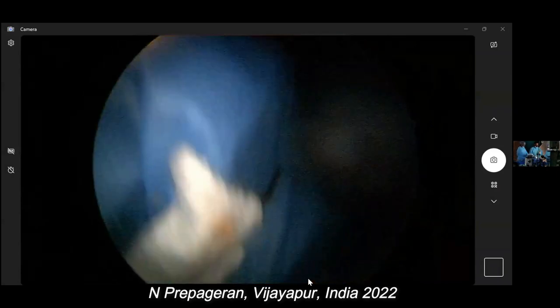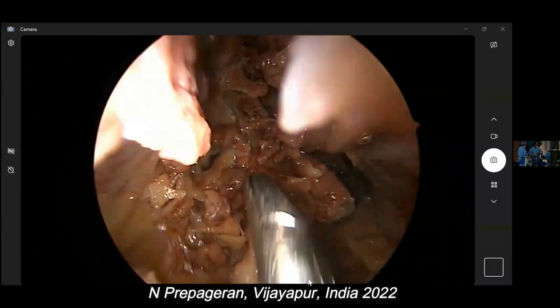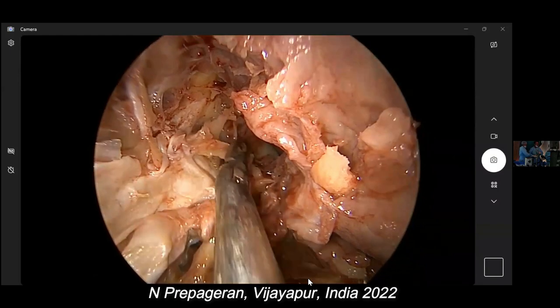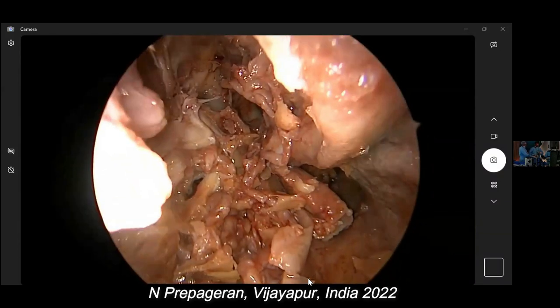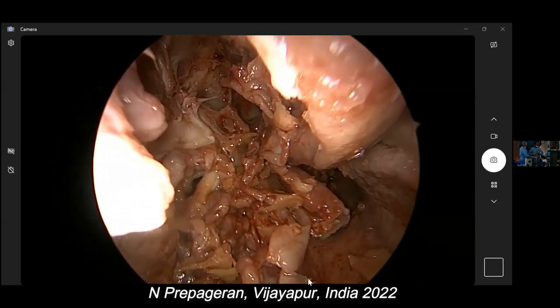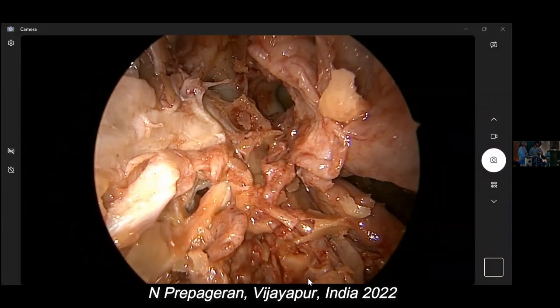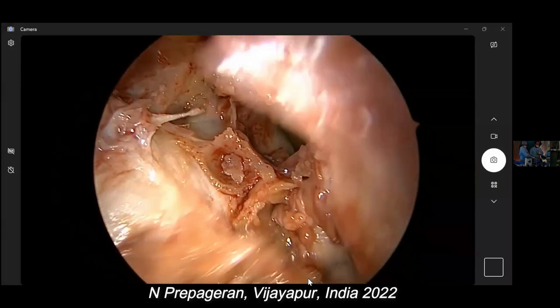So usually the bone here will be thin in the lateral recess. In this case, we don't have a lateral recess. You understand, guys? So I'm going to remove the bone here. Follow the V2. Can you see that the V2 is being removed?